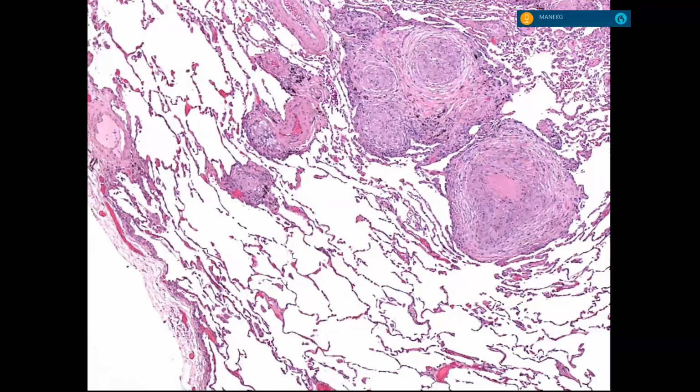This is not IPF. What is that? That's pleura. Pleura, very good. And alveolated lung, right? And then you have whorls. You have fibroblasts. You're right about the fibroblasts. There are some fibroblasts here. Silicosis, you're getting closer now.